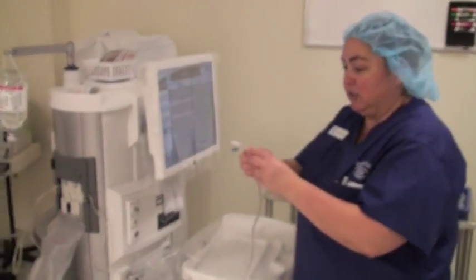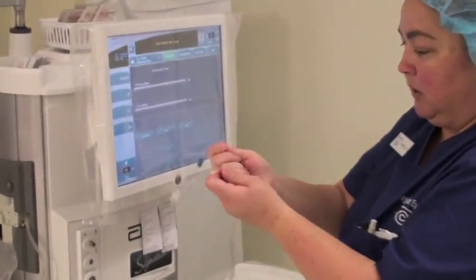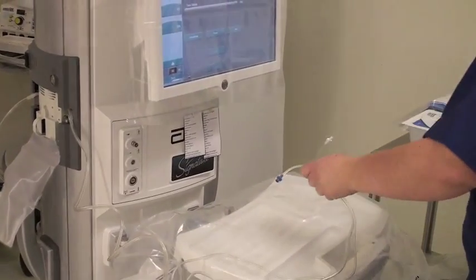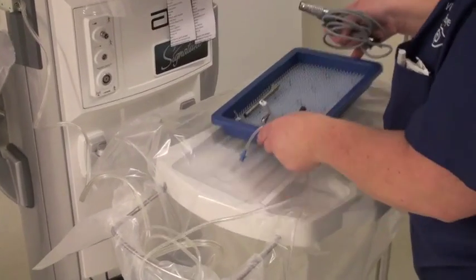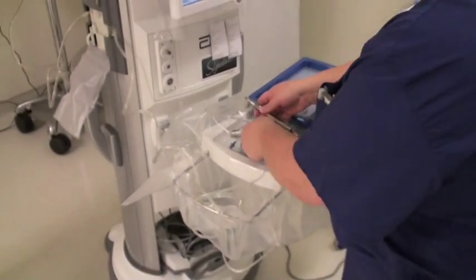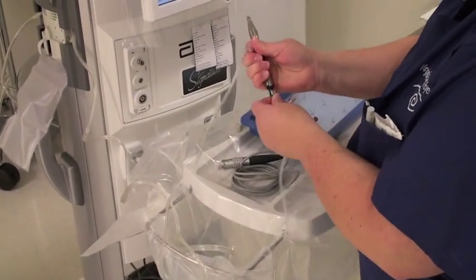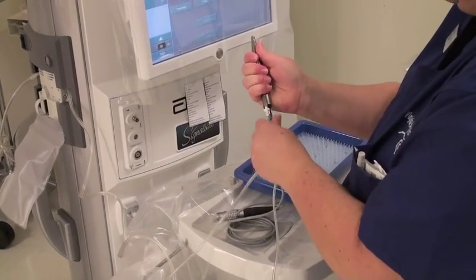The scrub technician is going to take the tubing — it's kind of stuck together, and you're just going to pull it apart. Then we're going to take our phaco tray and our phaco handpiece, and you're going to take the blue tip and put it there, and the white tip will go there. You just want to make sure they're in there tightly.